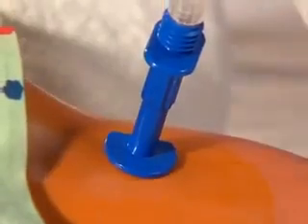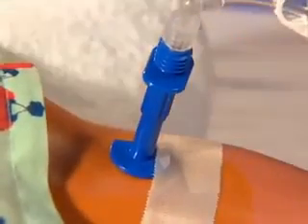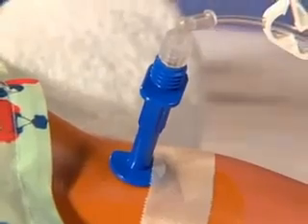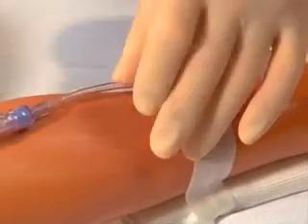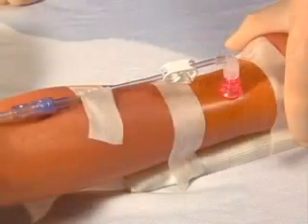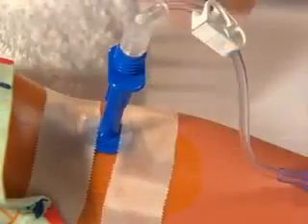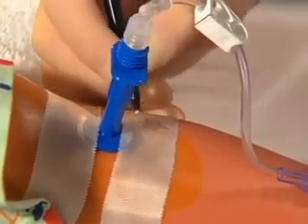You may place tape or sterile gauze around the insertion site. However, avoid the use of dressings that will prevent you from monitoring for infiltration, infection, or limb swelling. Use an arm board to provide additional stabilization. Secure the IV tubing away from the insertion site to avoid inadvertent movement of the catheter. Record the time and date of placement near the insertion site or on an identifying wristband.